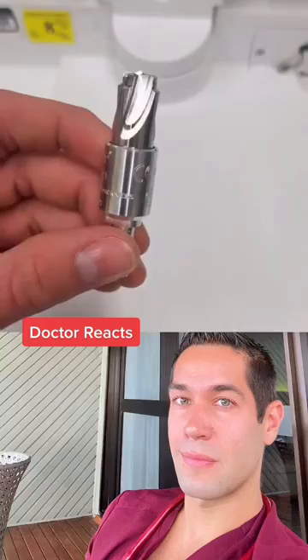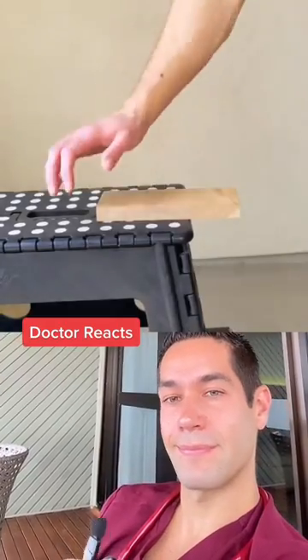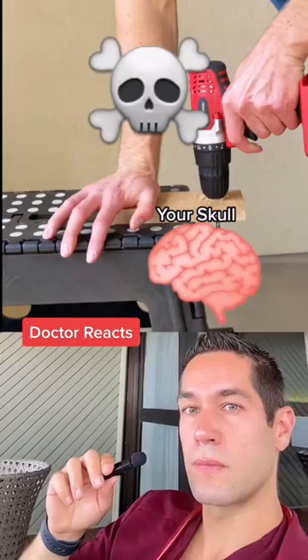If someone says drill bit to you, this is probably one of the first things you think of — something that you might find in your garage. This couldn't be used during surgery, however, because a surgeon could end up drilling too far, breaking through your skull bone, and going right into the brain.